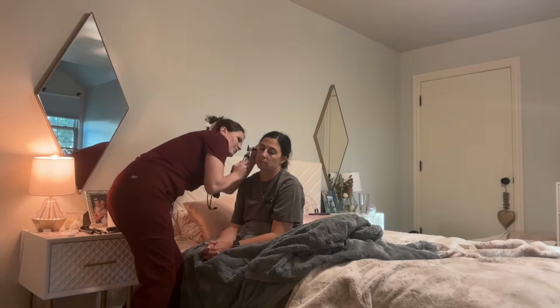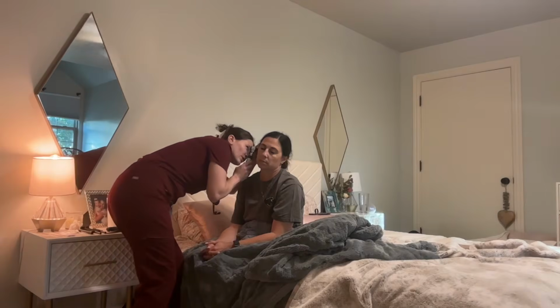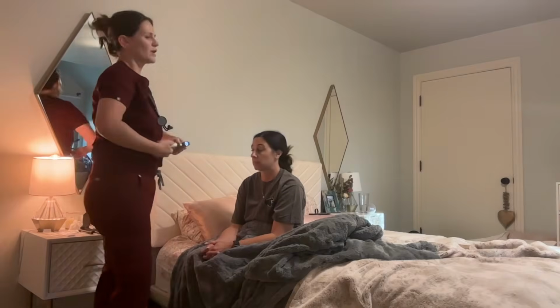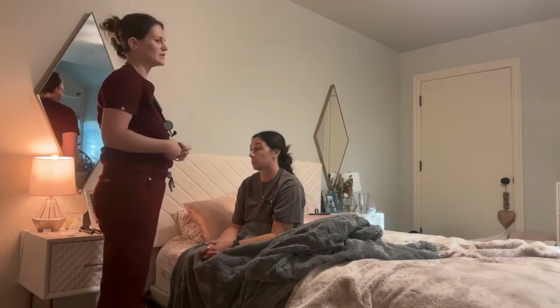Again, we're going to pull up and back to assess the tympanic membrane. Nice and pearly gray, minimal amounts of cerumen. The cone of light on the right side is at 5 o'clock.